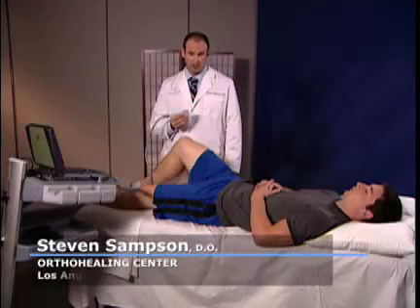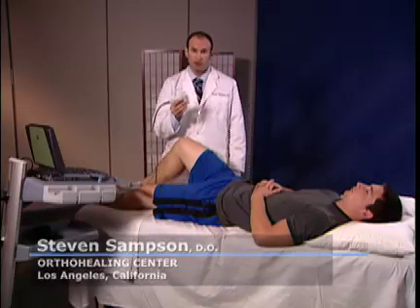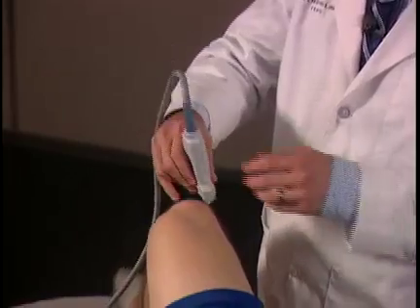We're going to begin scanning the right knee. I like to begin the scan by starting at the quadricep tendon with the transducer, with the notch facing towards the patient upwards in a longitudinal plane.